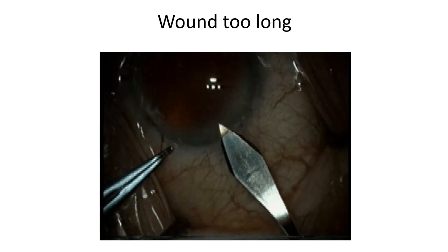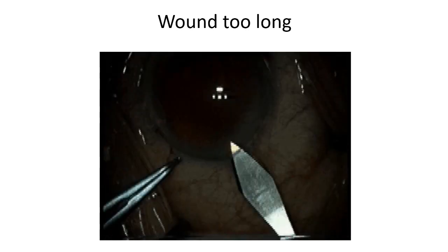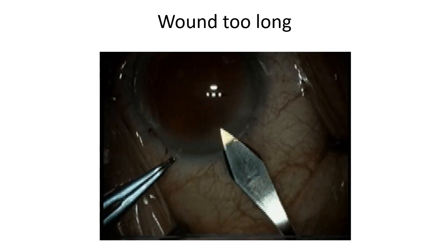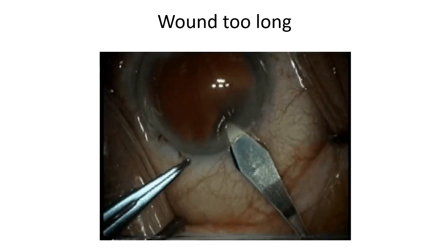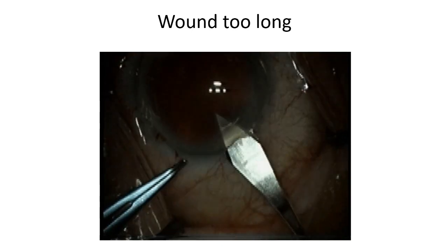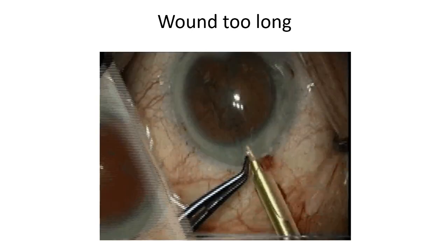This is the very next case by the same surgeon. This time, in order to avoid it being too short, it becomes too long and too close to the limbus. It means that the wound actually goes out into the conjunctiva, and you'll see what happens.